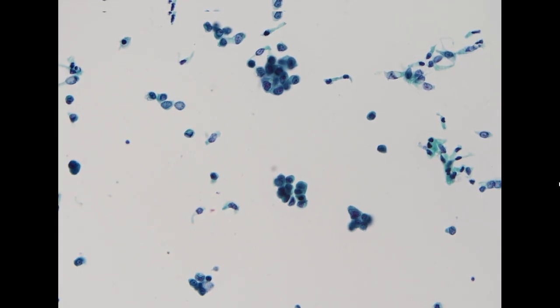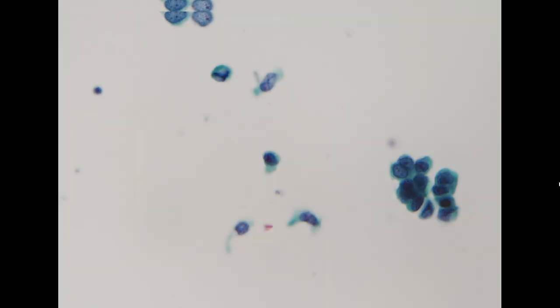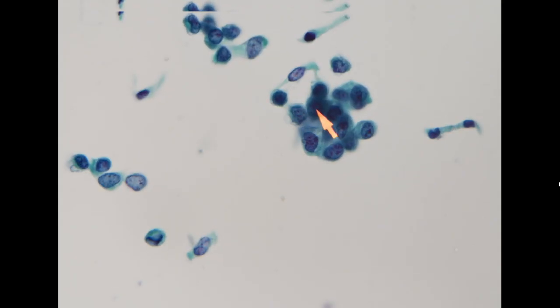In this specimen, we can see most of the cells have an enlarged nucleus with relatively polymorphic nuclei and irregular nuclear membrane. Most of the cells have very hyperchromatic chromatin. The chromatin pattern has some coarse granules within the nucleus, so this is coarsely granulated.